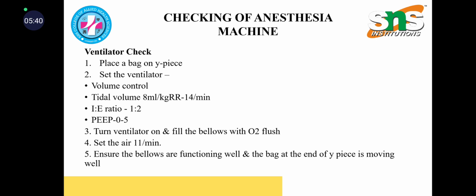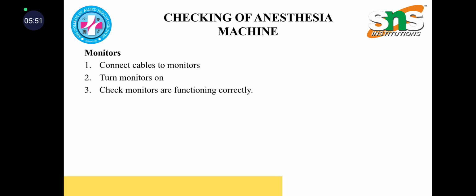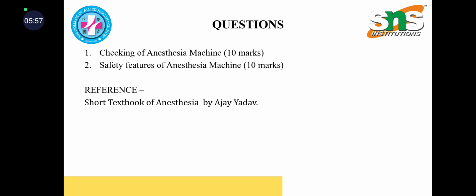Set the air at 1 liter per minute. Ensure that the bellows are functioning well and the bag at the end of the Y piece is moving well. Monitors. Connect cables to the monitors, turn monitors on, and check monitors are functioning correctly.